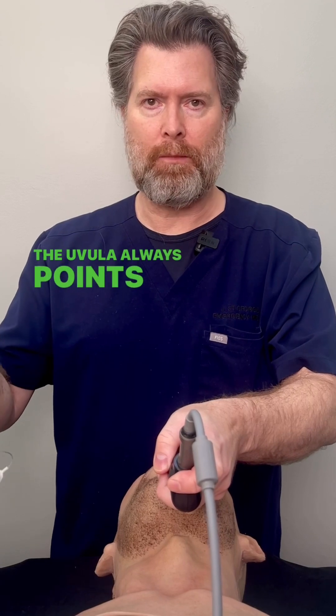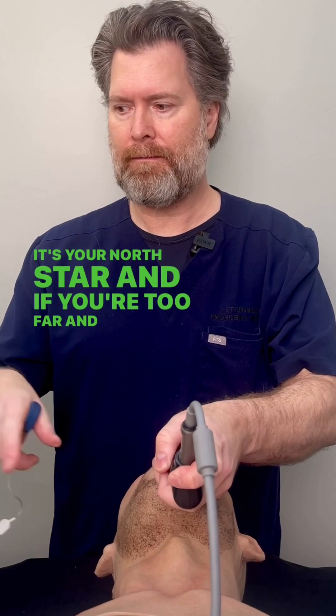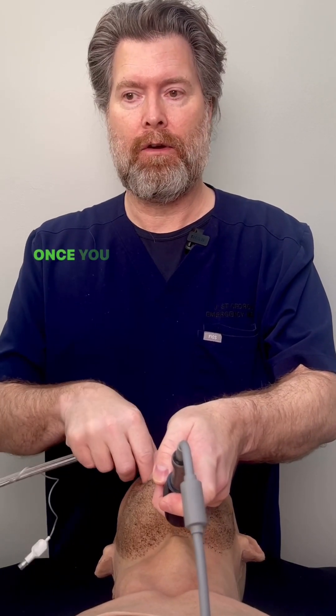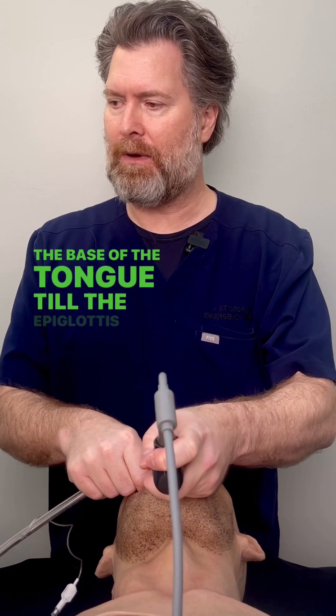The uvula always points your way to the epiglottis. It's your north star, and if you're too far and you don't see it, you need to pull back. Once you have the uvula in view, you're going to tiptoe down the base of the tongue until the epiglottis comes into view.